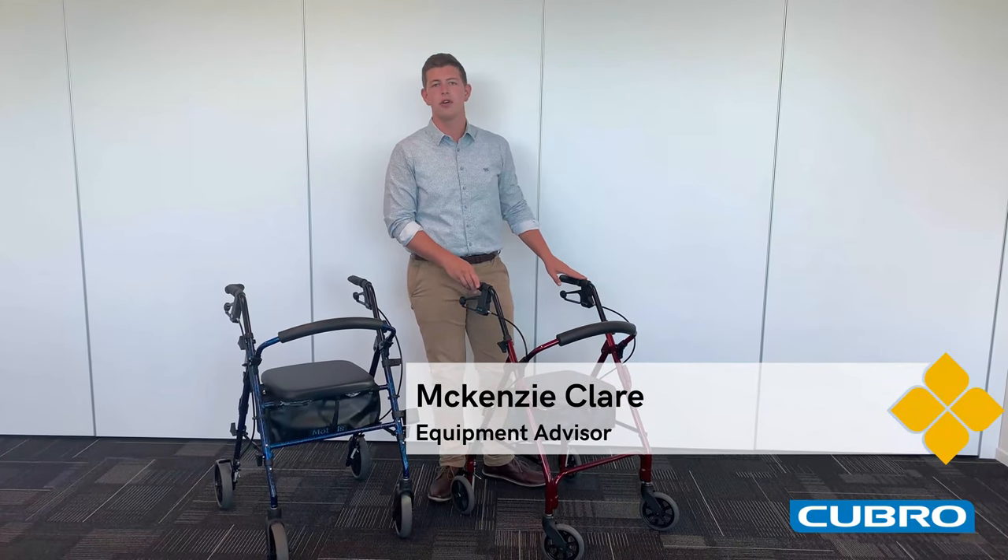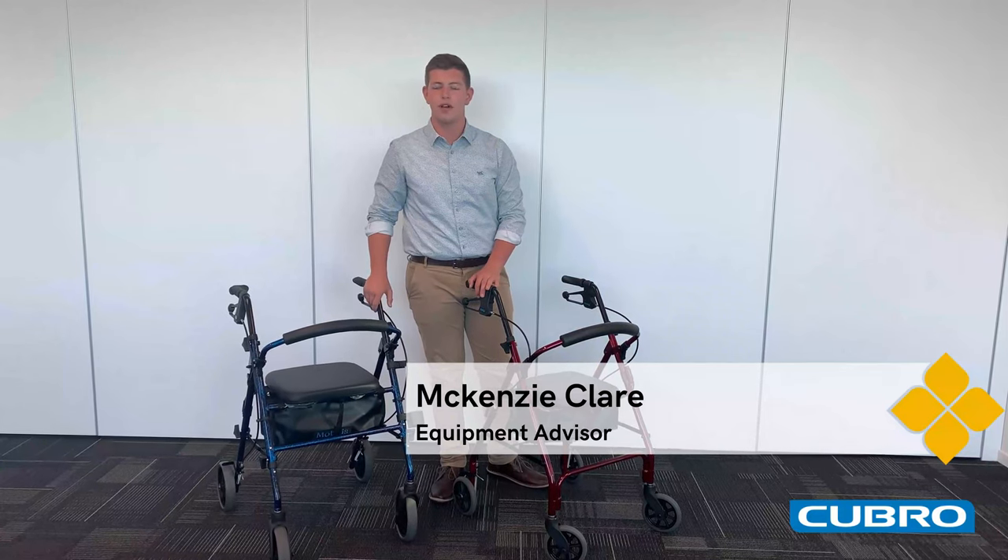Hello, my name's Mackenzie from Cubro and today we're going to run through two of our Mobilis walking frames.